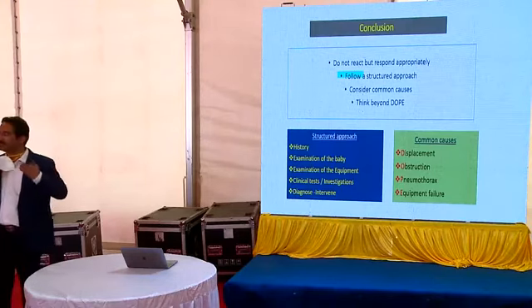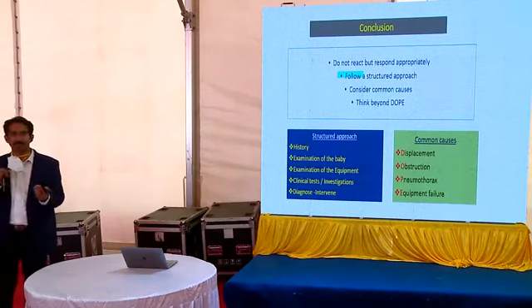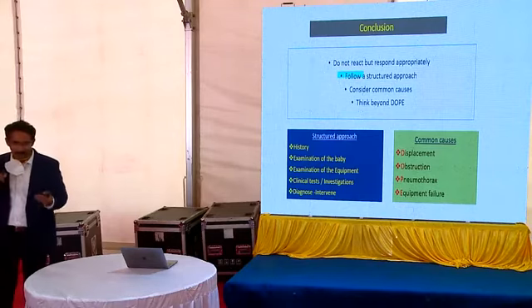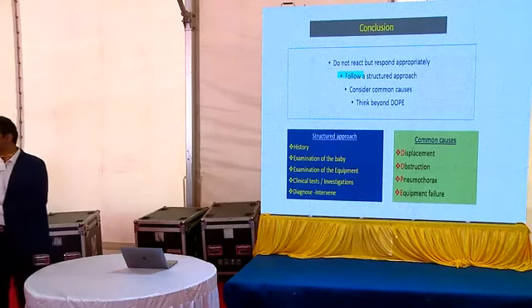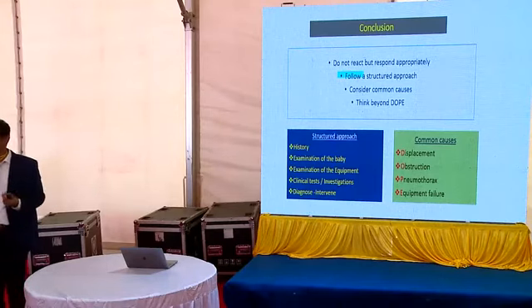So we had a situation where the baby was not improving at all. You bag the baby, baby improves, connect to ventilator, baby is not breathing. What had happened was the flow was turned to 0 and we didn't realize. And it is not a common thing that we frequently see. Okay. So sometimes a new person walks in and says, hey, the flow is very less for this baby. Okay. So work as a team and we will be able to save most of these babies.